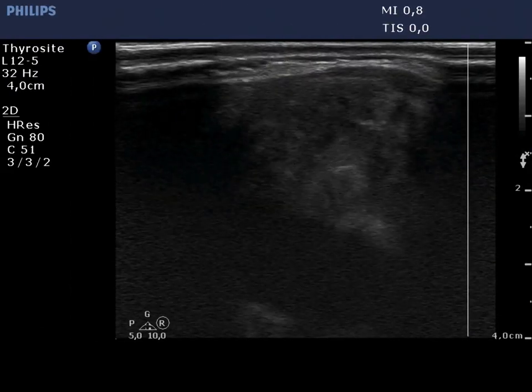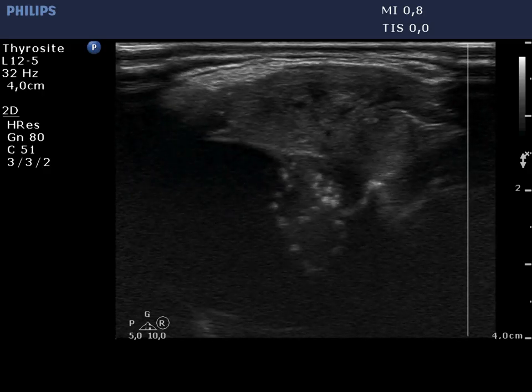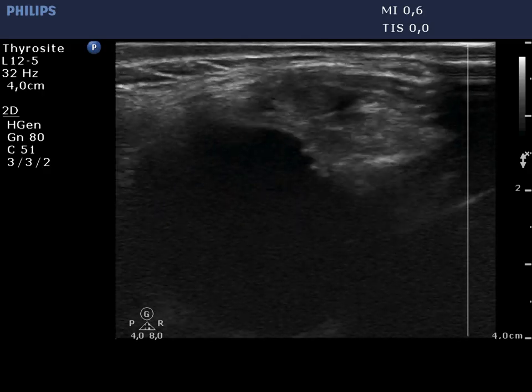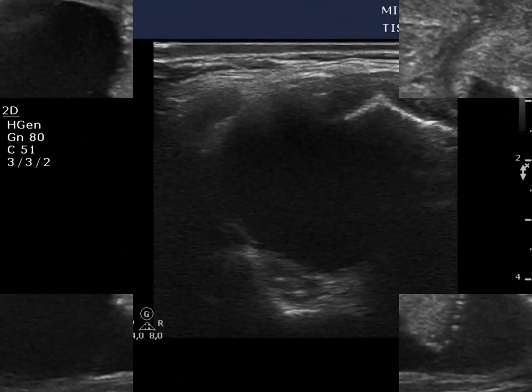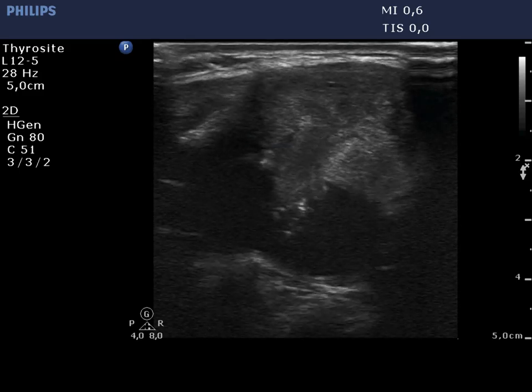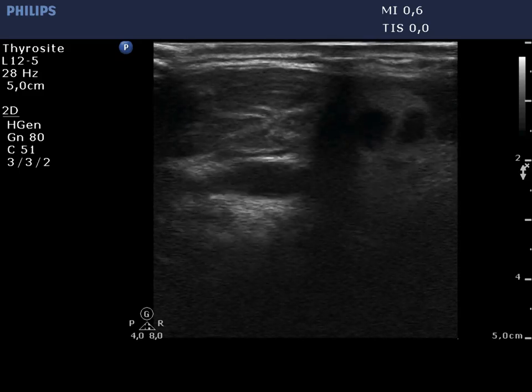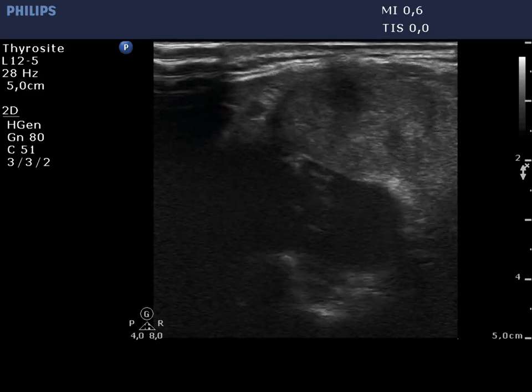A large cystic nodule occupies almost the entire lobe. The solid part contains microcalcifications. The depth had to be reset in order to visualize the dorsal part of the lobe.